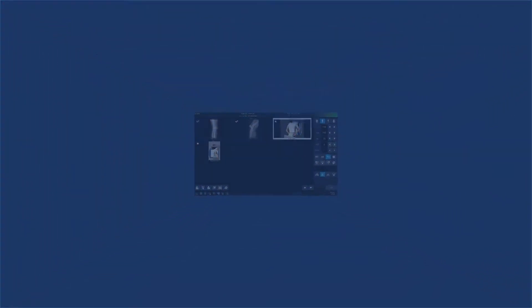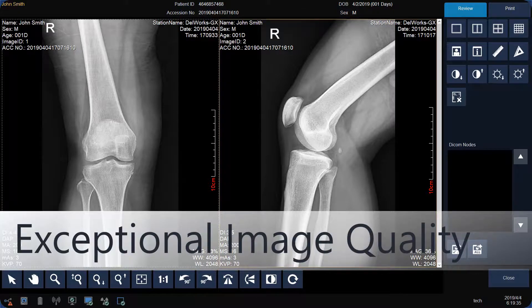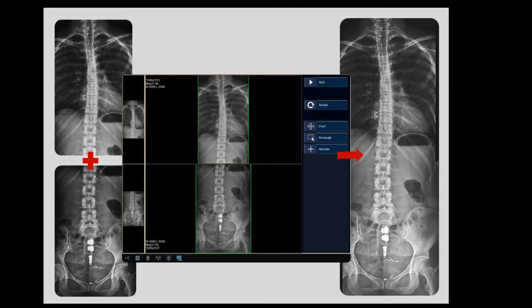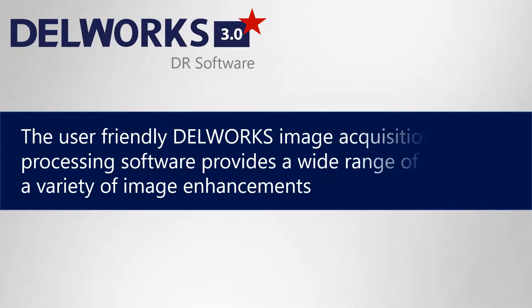It provides outstanding image quality requiring little to no technologist intervention. Advanced options such as image stitching combine multiple images into one, easily and accurately. DellWorks provides a wide range of imaging tools for a variety of image enhancements.